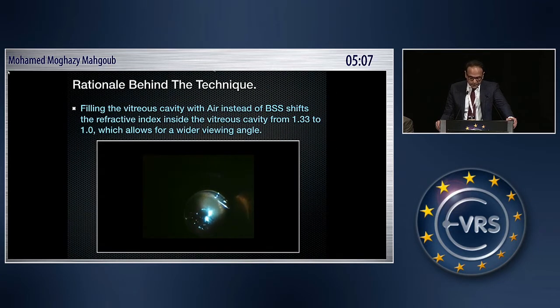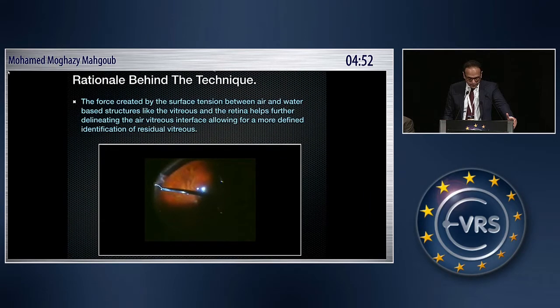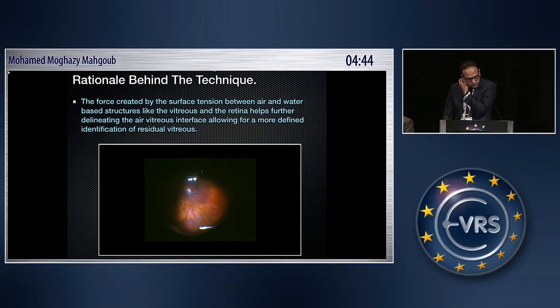Filling the vitreous cavity with air instead of BSS shifts the refractive index inside the vitreous cavity from 1.33 to 1.0, which allows for a wider viewing angle. Together with the wide-angle viewing system, this is of special importance in narrow pupil patients and in patients with peripheral lenticular opacities. The force created by the surface tension between air and water-based structures like the vitreous and the retina helps further delineate the air-vitreous interface, allowing for more defined identification of residual vitreous.